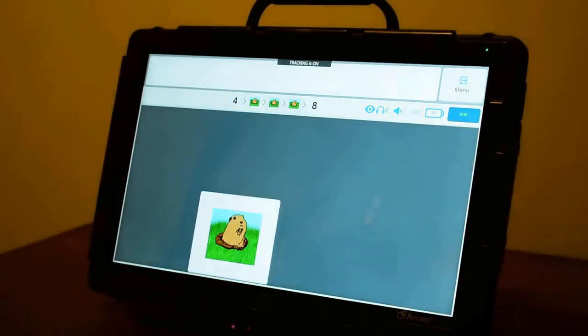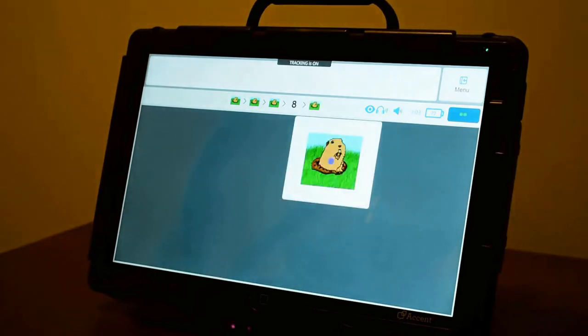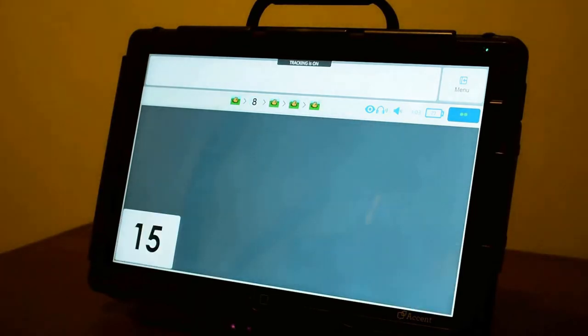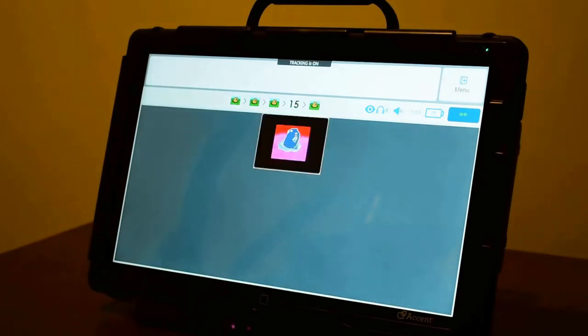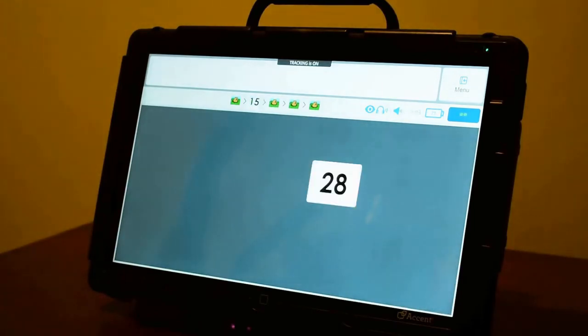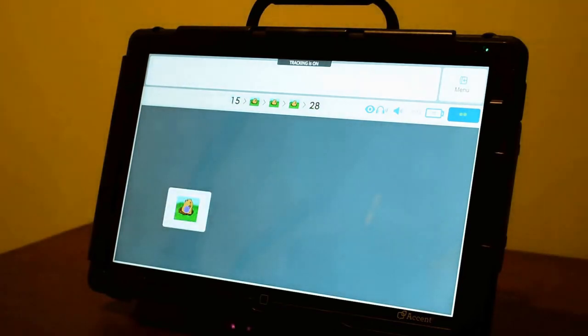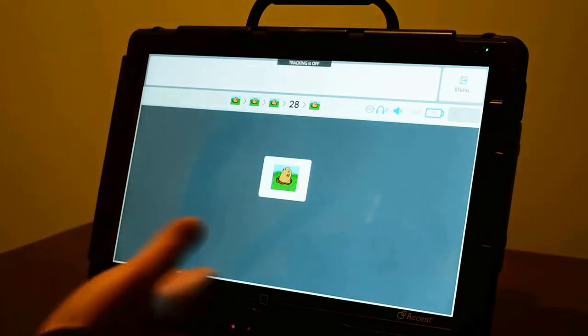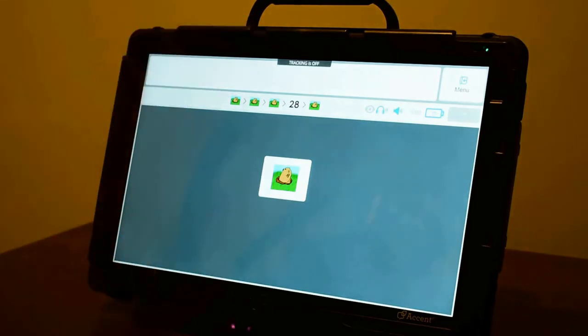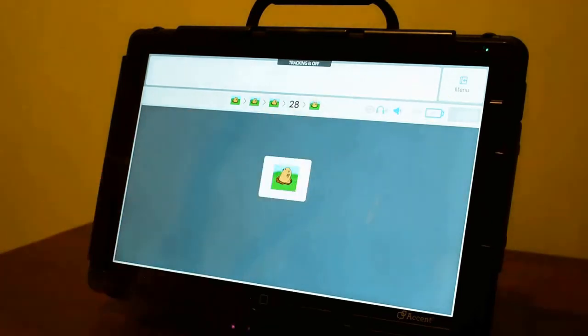Now I'm going to an 8-button grid, 15-button grid, and these gradually just get smaller. If I need to take a break, I can look up to the pause resume dropdown, take a break, look around. Nothing will select at that point other than resuming the system. Again, the clinician or caregiver can select the track status to resume the system as well.